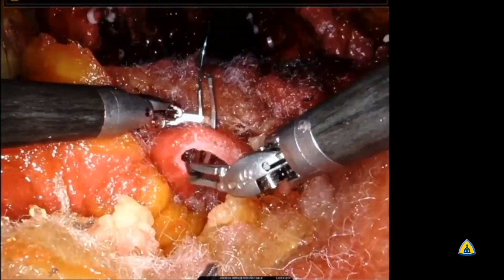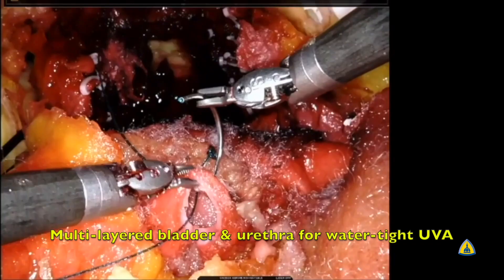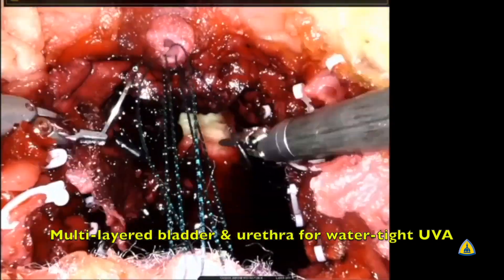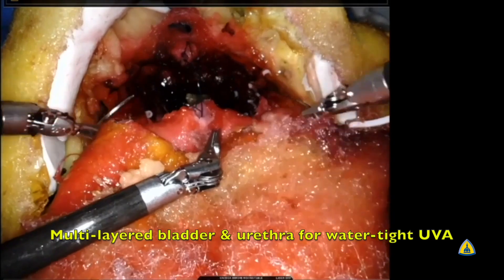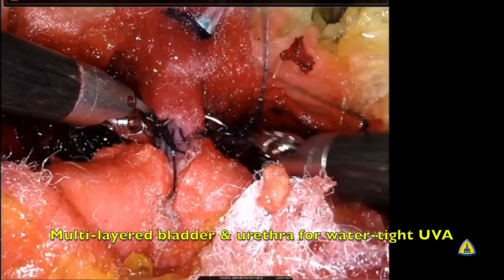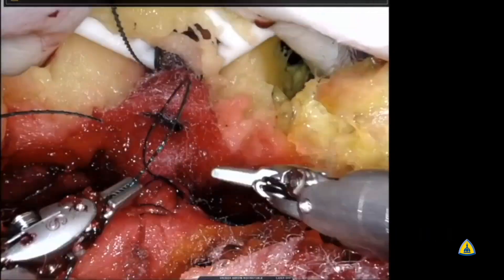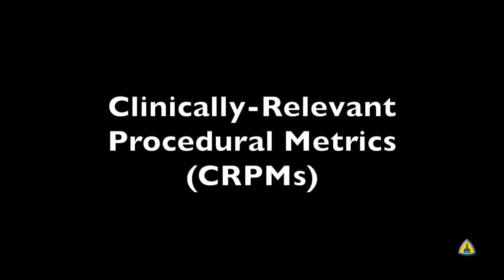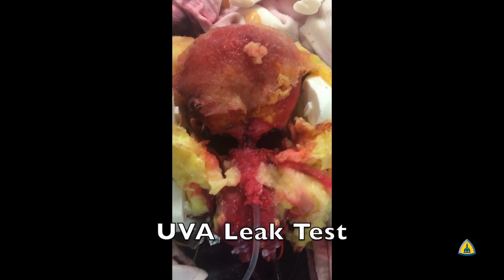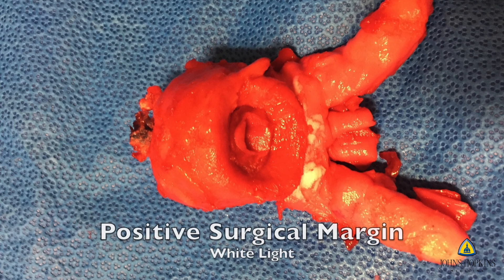Once the neurovascular bundle dissection is completed, we move to the final part: the anastomosis. This is not simply suturing a bladder to a tube — it's within the context of a bladder under tension requiring the fourth arm to push down, with a pubic symphysis that can cause instrument collisions. You can then test the water-tightness of the anastomosis by removing the pubic symphysis and filling the bladder with about 150 cc of saline to see if there's any fluid leaking.